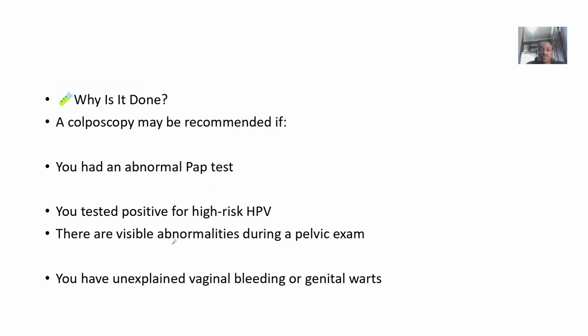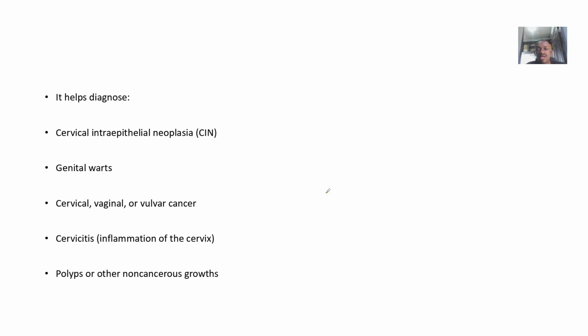All right. So why is it done? A colposcopy may be recommended if you have an abnormal pap test. Right. Maybe you tested positive for high risk human papilloma virus, or maybe there are visible abnormalities during a pelvic examination, or maybe you have some unexplained vaginal bleeding or genital warts. So it helps to diagnose a lot of problems that could occur in the genitals, like cervical intraepithelial neoplasia, genital warts, cervical, vaginal, vulvar cancer, cervicitis, that's inflammation of the cervix, also polyps.